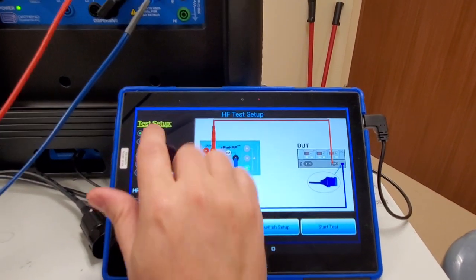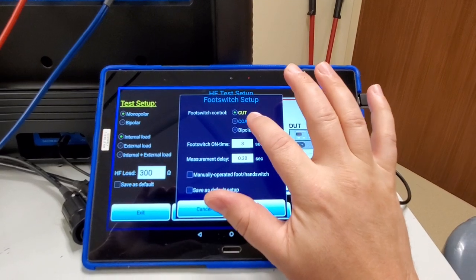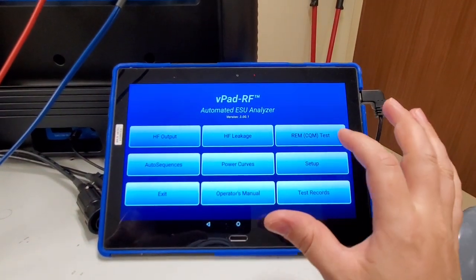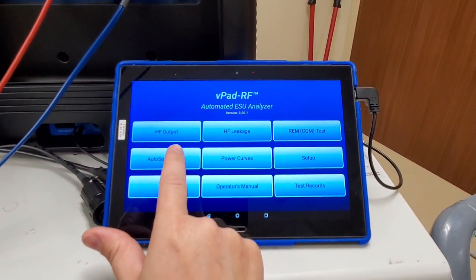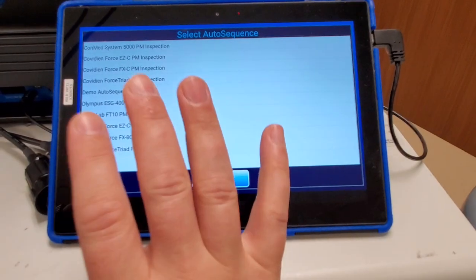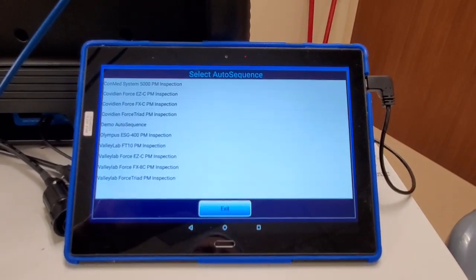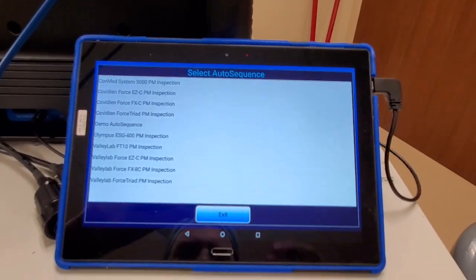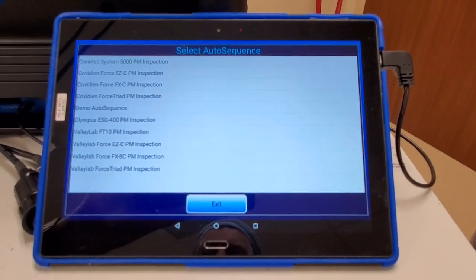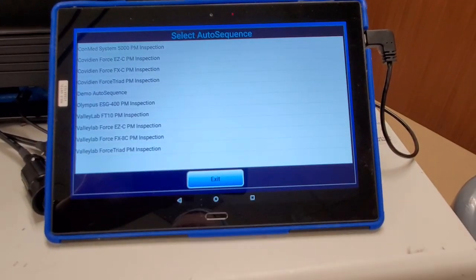This unit has just a couple of features that drive me absolutely crazy. In the high frequency menu, I have to pop into the menu, select what I'm going to do, hit apply, and then I can do my test. Going into auto sequences - it has a good selection of auto sequences that take you step by step through the PM of all these various devices, which is excellent, except that a lot of the clicks you have to do have extra steps. Some screens you have to click off of are just for information, and you have to click through them - it's just one more slideshow.